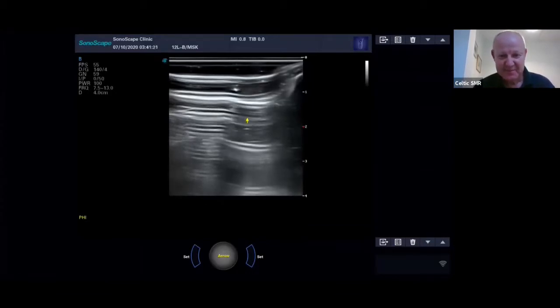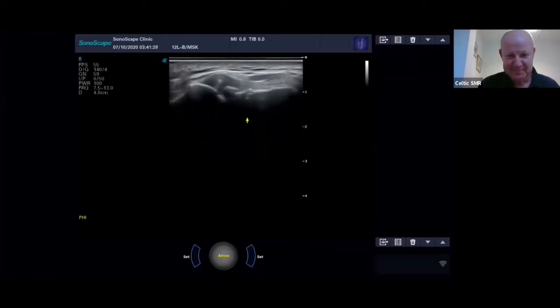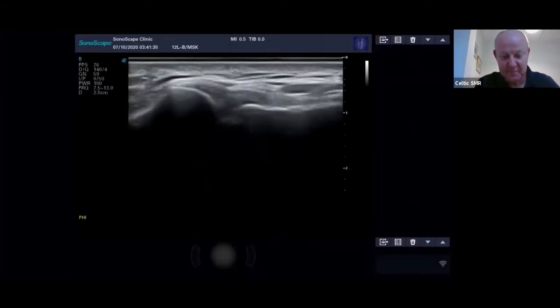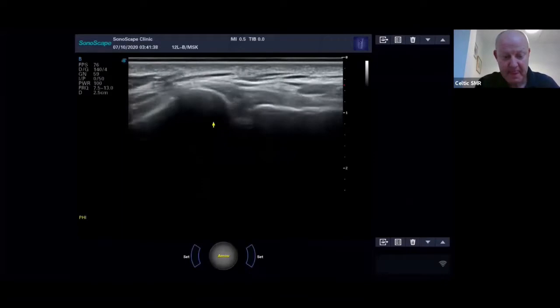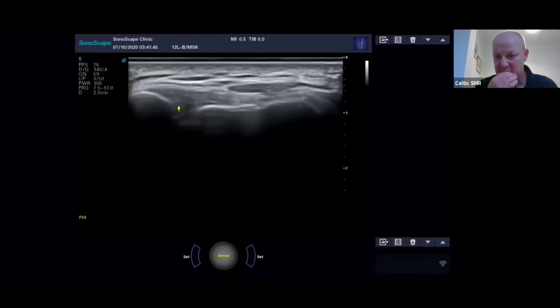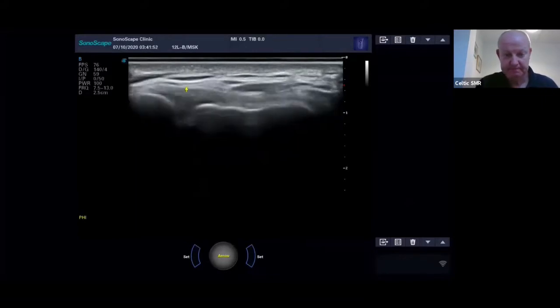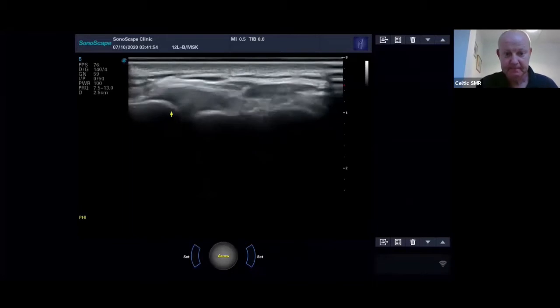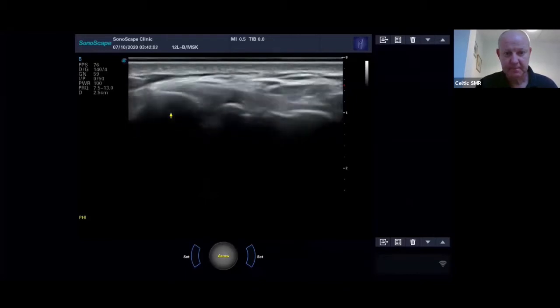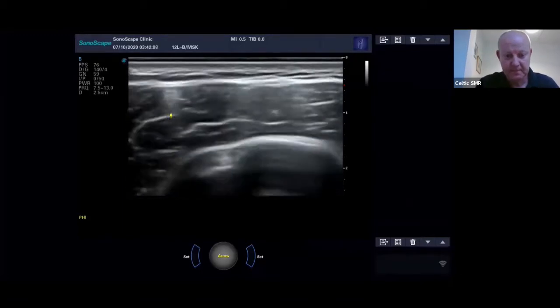So, shall I go through the shoulder as I would do it? I'd start with the ACJ. Optimise the image. So you've got the acromion end here, the acromioclavicular joint, the acromioclavicular ligament going across the top, and the capsule here. That's me shrugging my shoulder just to show some movement. Yeah, there you go. Okay. And then once I've looked at that, I then go down onto the biceps tendon, which is what we started with today.